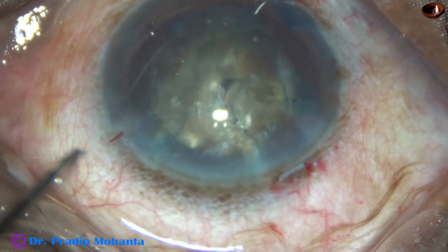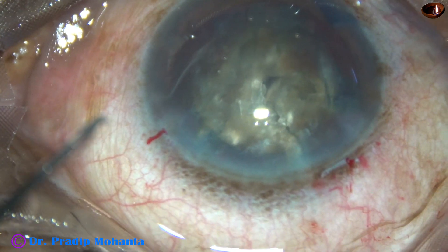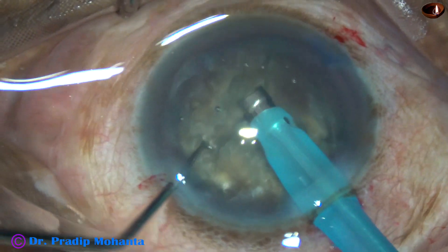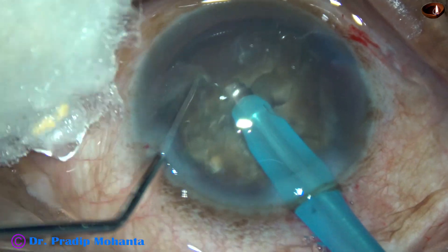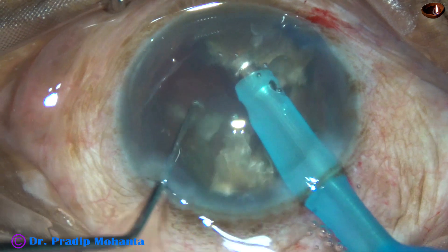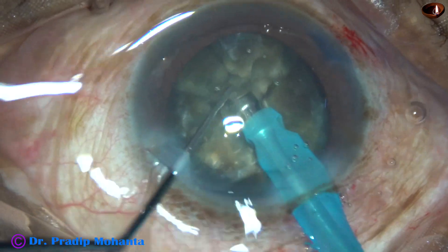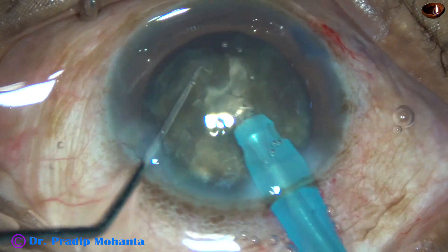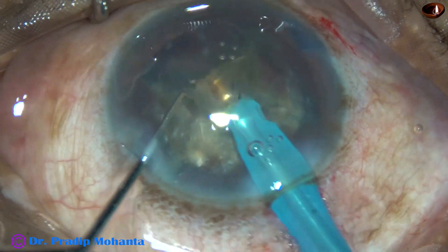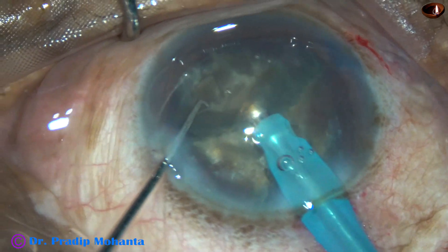Now the smaller heminucleus has not been divided into pieces. I am going to see if I can divide this smaller heminucleus into two free fragments. I get a nice crack and yes, I have got two free fragments. So I emulsify these two fragments, and later on I will see what I can do with the other bigger heminucleus. This is the other free nuclear fragment.